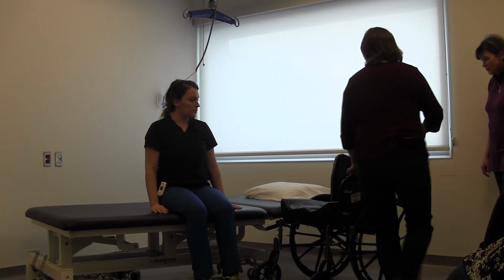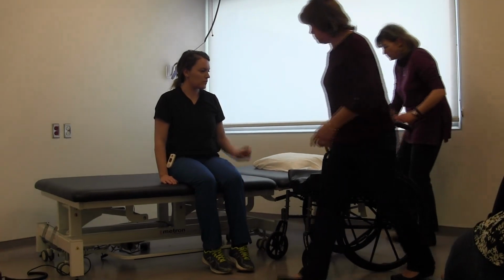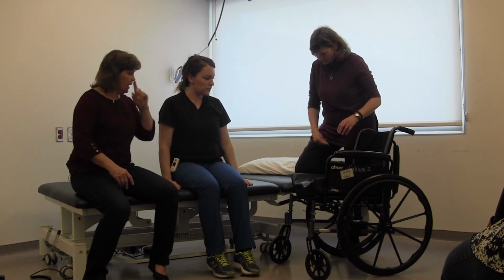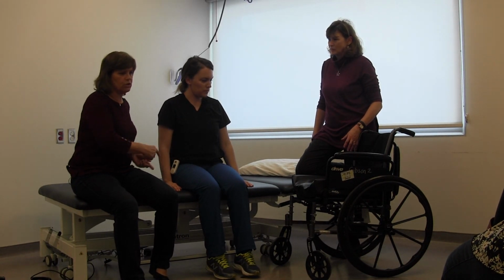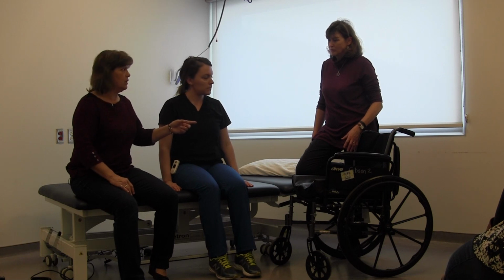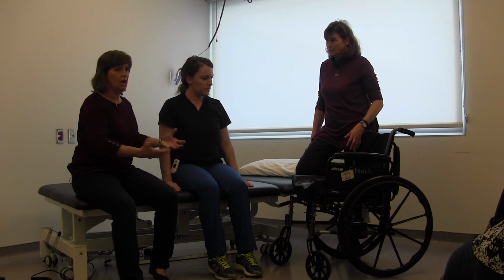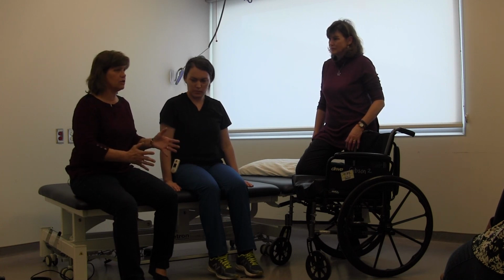So the chair is going to be changed a little bit in terms of its angle so that Barb can get in between. Now, the person from behind has to be careful in that when we're doing this transfer and we're shifting and twisting somebody, they're already putting their back in a position of a twisted fashion, and you'll see that in a minute when Barb puts her arms underneath the hips, okay? So you have to be very careful keeping your back straight.